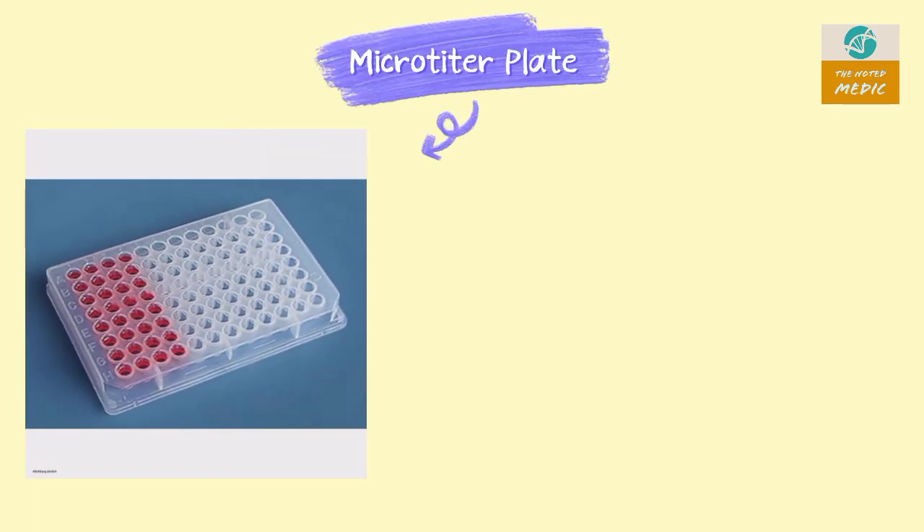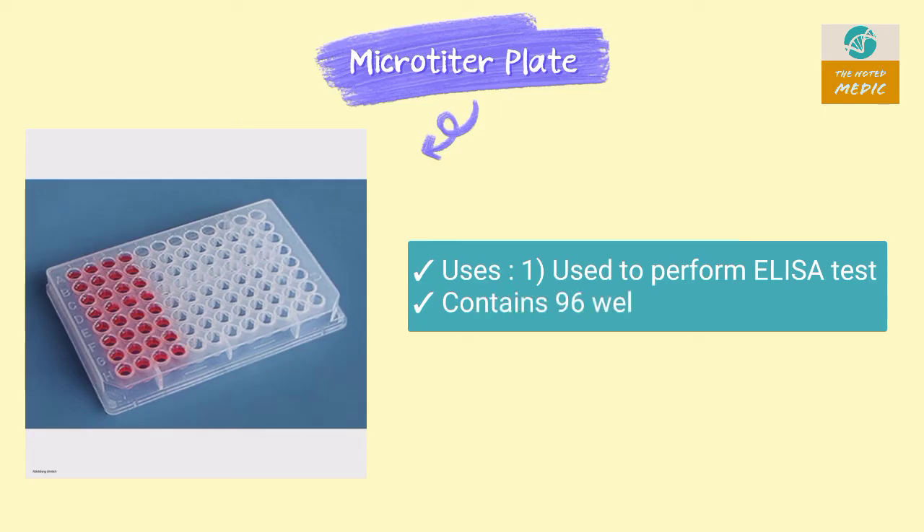This is a microtiter plate. It is used to perform the ELISA test. It contains 96 wells.